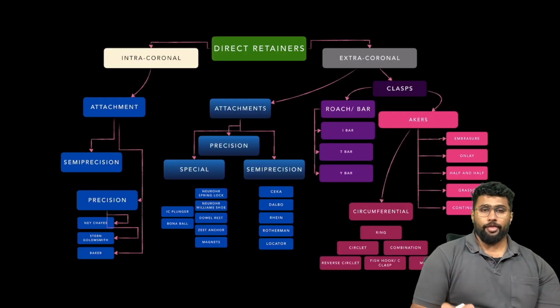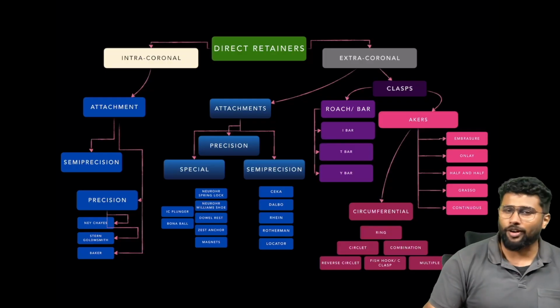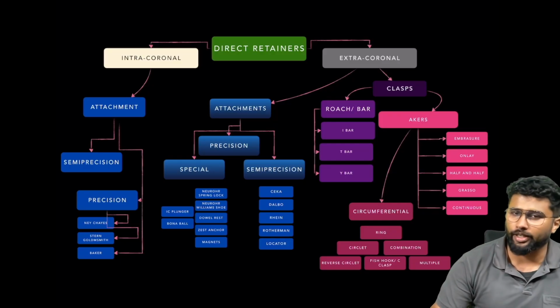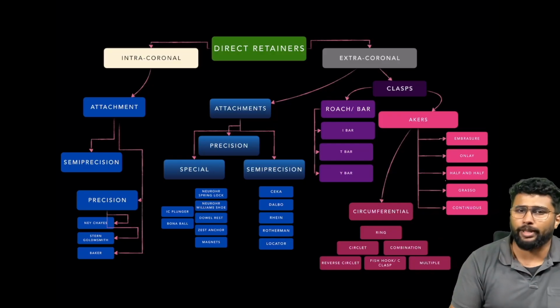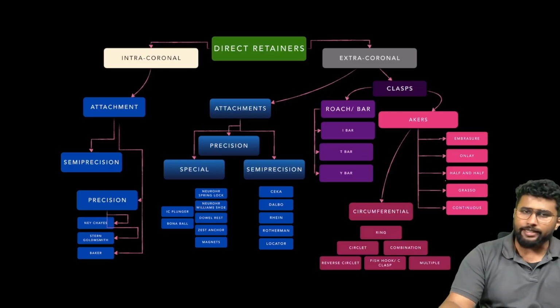Now, don't get scared looking at this. It is just basically a classification of all the different direct retainers that are there. I just put everything together so that it's like a nice compilation, and you guys don't have to go searching elsewhere. Now, it is very easy.